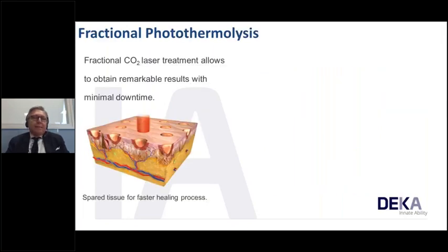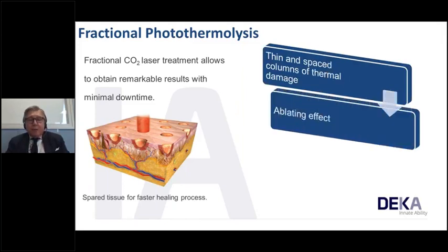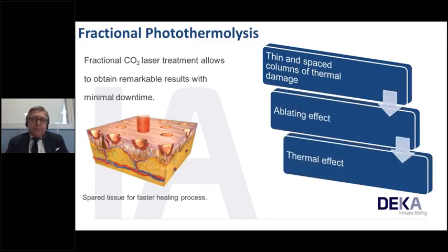Fractional photothermolysis is a treatment that allows to obtain remarkable results with minimal downtime. We know this because we spare tissue for a faster healing process. We exploit the thin and spaced columns of thermal damage. We have a microablating effect and thermal effect in the tissue.